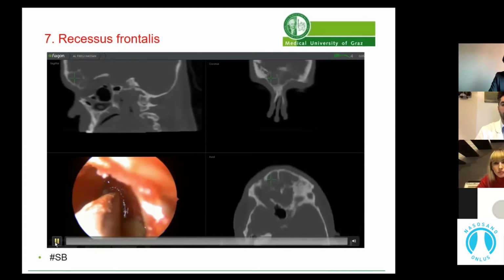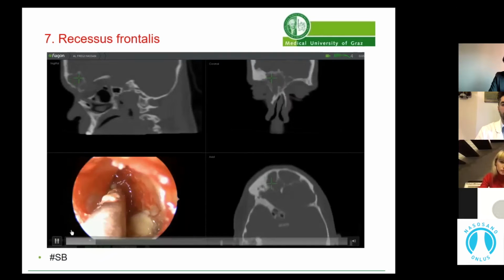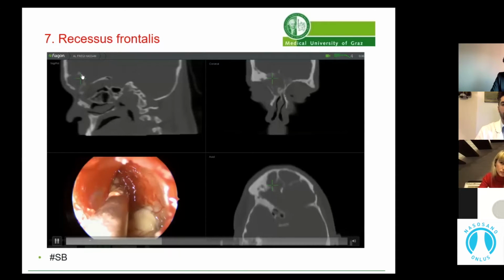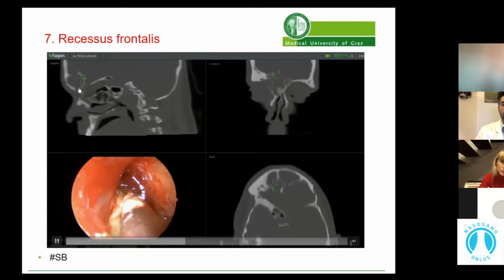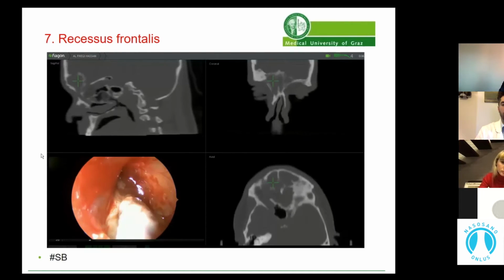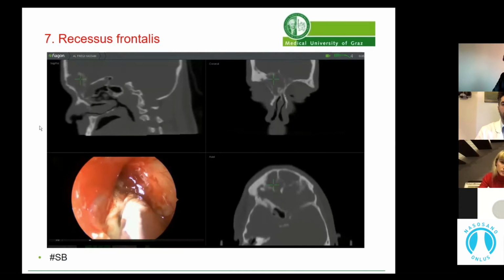This can be a more complex frontal sinus case. Here, a patient who was wounded in the Iraq war. Here, of course, we performed an open approach because here major parts of the dura were lying free, and we needed to drill down to reconstruct our way to the nasal cavity. And in this case, we also used some stents in order to provide patency as long as possible.